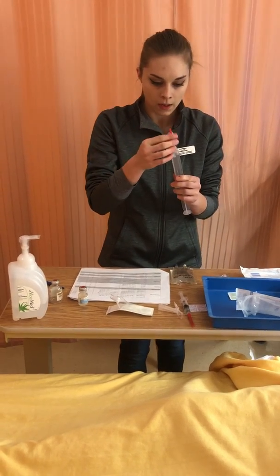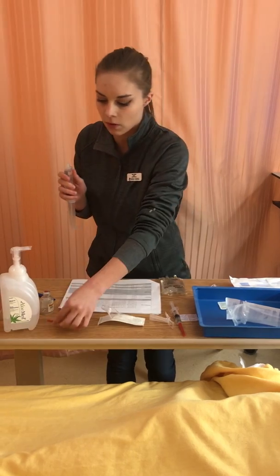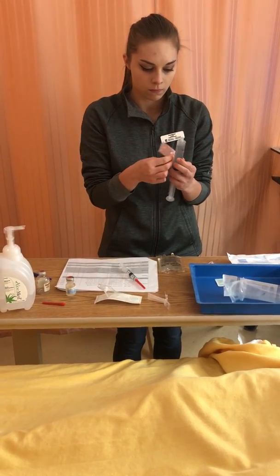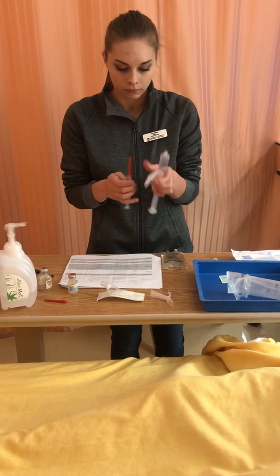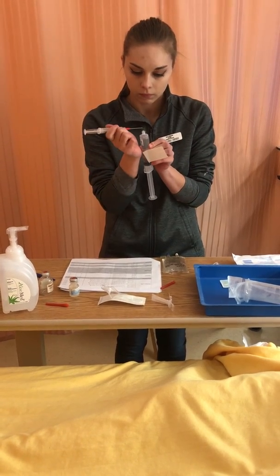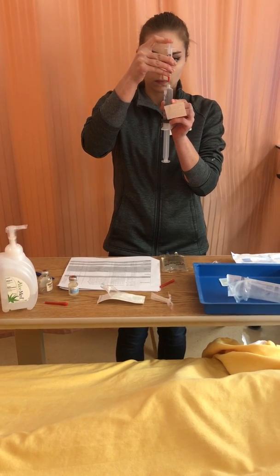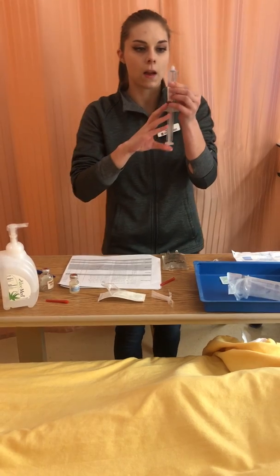There are other rights that I need to cover. My needle would go in the sharps container. The rights education is what I provided to my patient. I also have to go ahead with right documentation. Once I finish administering my patient's medication, I'll sign on my mark. I'll also dispose of the syringe, and that would go in the sharps container as well.